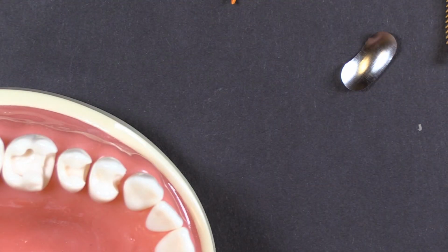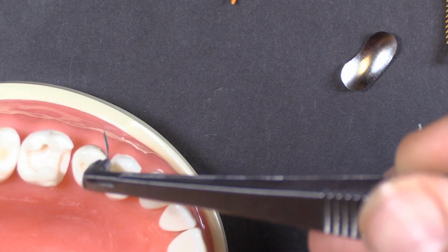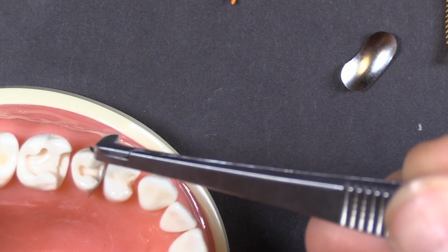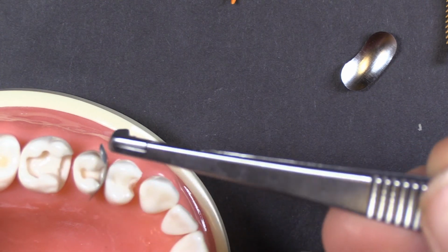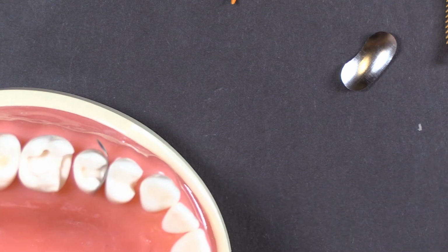This is the typical band that you would use. I'm using a little shorter one here, shorter in buccal or gingival occlusal height. Okay. So now you can see if you had two of those in there, you're not as likely to have the ends interfering with each other because they're so much shorter.